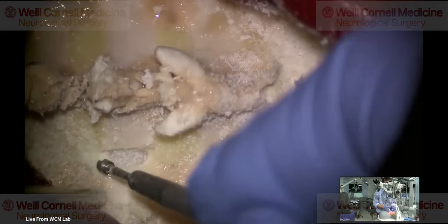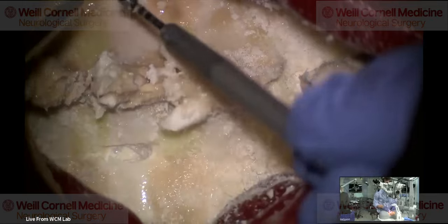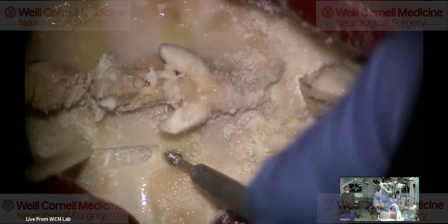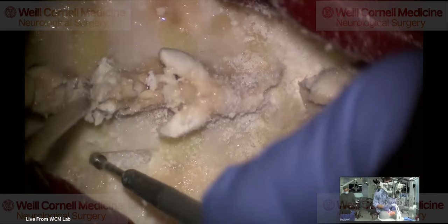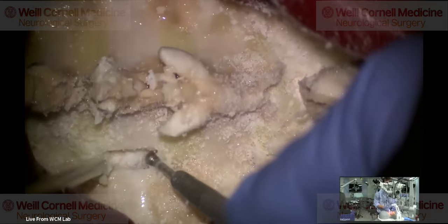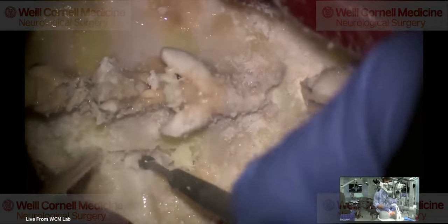And how do you decide the side? Where do you do the full cut and the partial? The full cut side opens a little bit more than the partial cut. So whichever side is more symptomatic in terms of myelopathy and whichever side is more compressed, that's the side I will do. If it's equal, then I'll typically stand on the patient's left and do it that way. But today I decided to stand on the patient's right because the model was facing this way. Doesn't really matter. I think as a surgeon, you got to get used to standing and doing this on either side.